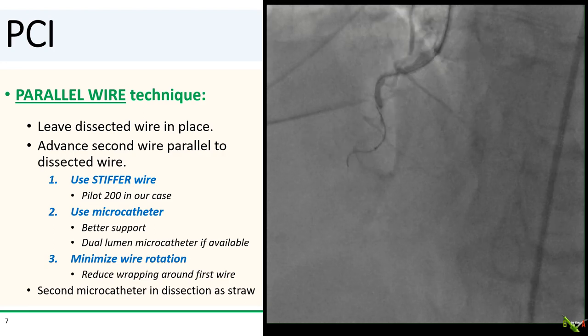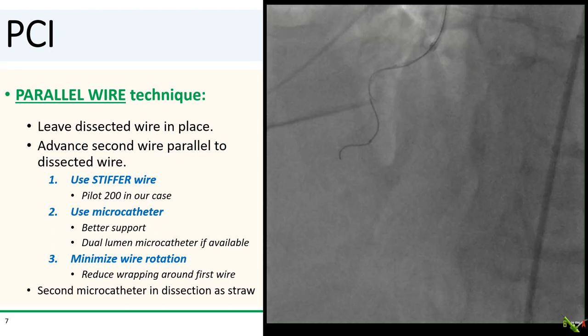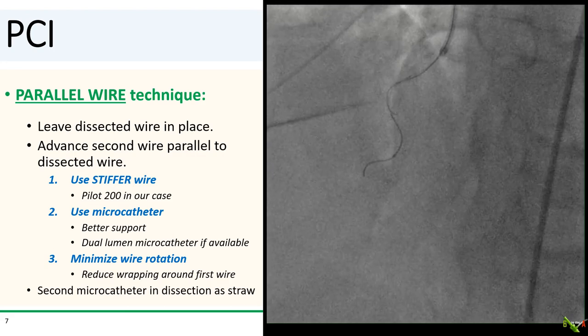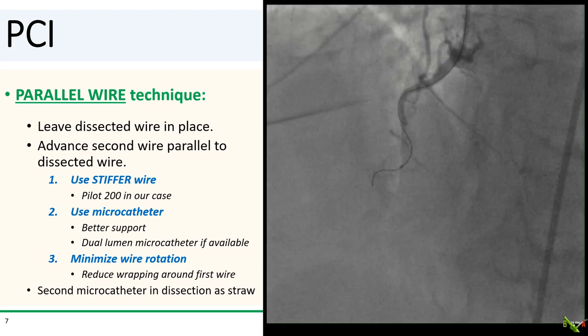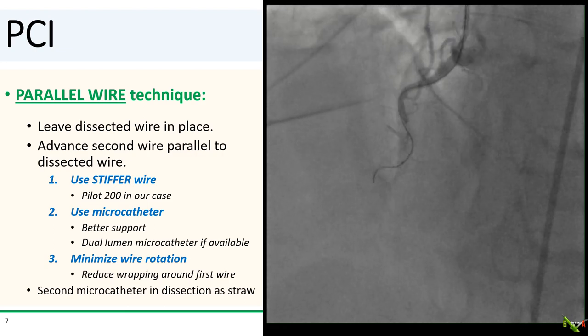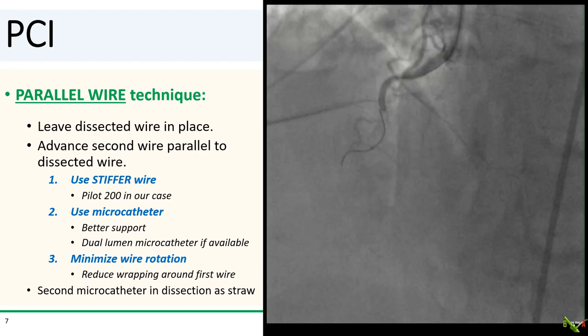As you're advancing the parallel wire, minimize wire rotation to reduce wrapping around the first wire. Sometimes placing a microcatheter into the dissection itself can help. You can use the second microcatheter as a straw to aspirate the intramural hematoma and collapse the false lumen. This enlarges the true lumen and may make it easier for your parallel wire to re-enter.